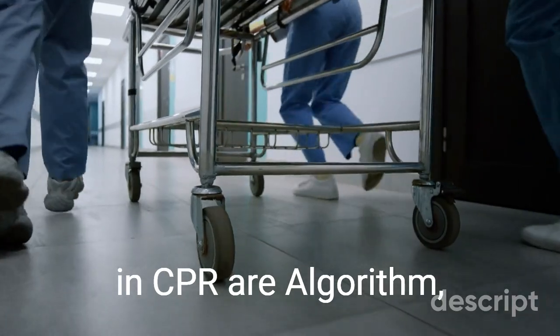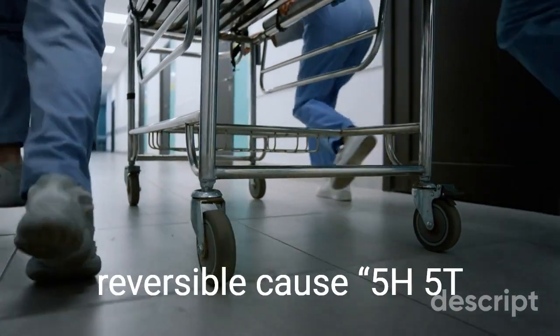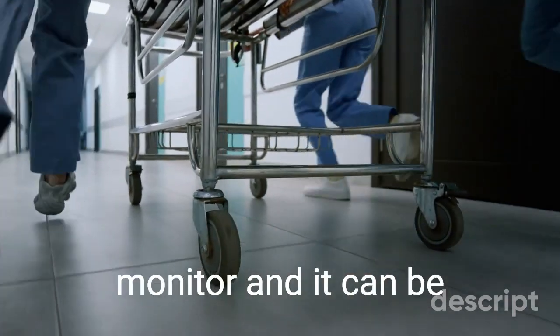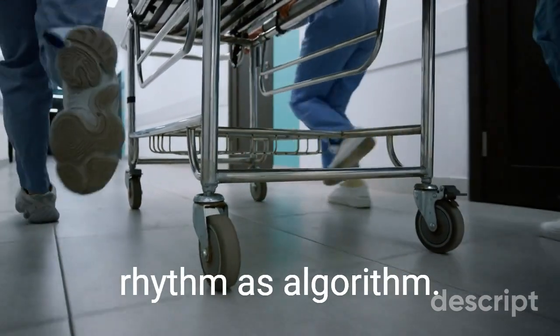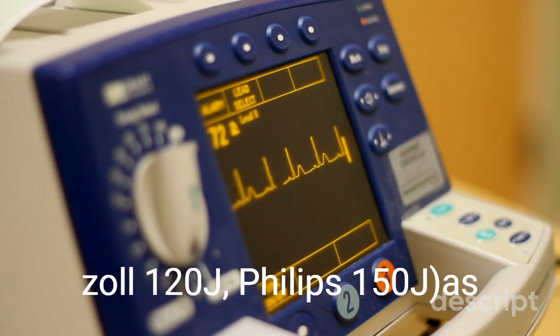Key points in CPR are the algorithm, effective chest compressions, and determination of the reversible cause, 5H5T. When the defibrillator arrives, attach an EKG monitor, and the rhythm can be distinguished into shockable or non-shockable, as in the algorithm. Algorithm VF/PVT: shock biphasic 120-200 J, as recommended by the manufacturer, as soon as possible.